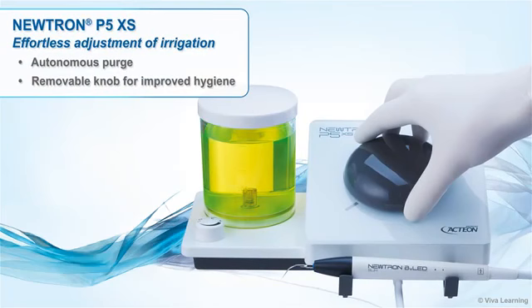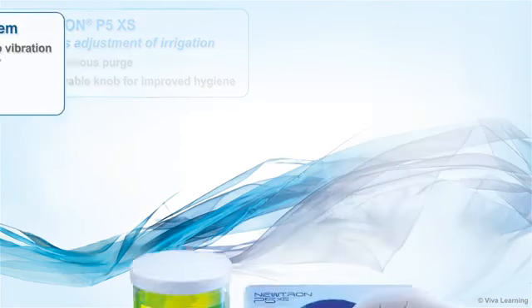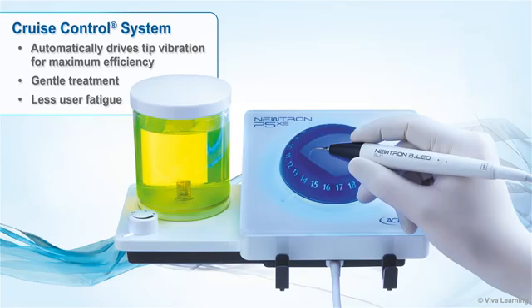The P5XS also offers effortless adjustment of irrigation, autonomous purge, and a removable knob for improved hygiene. The cruise control system automatically drives tip vibration for maximum efficiency, a gentle treatment, and less user fatigue.